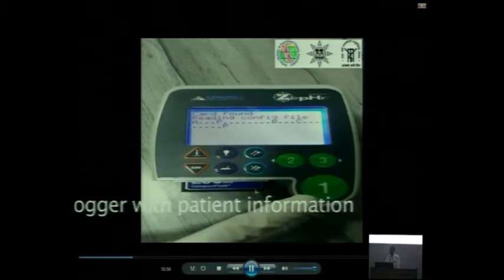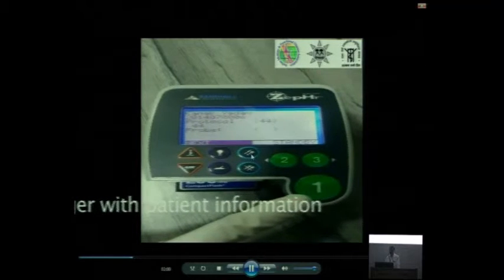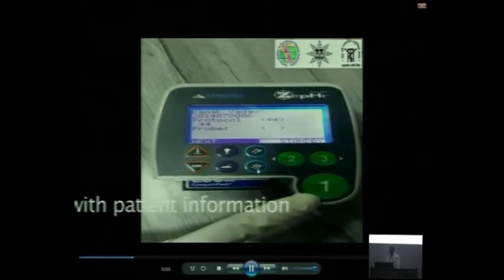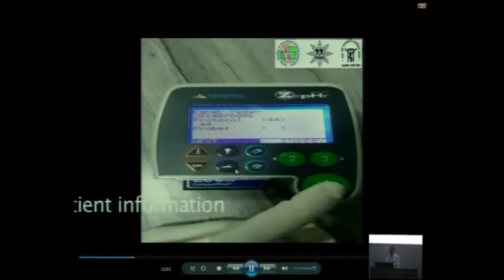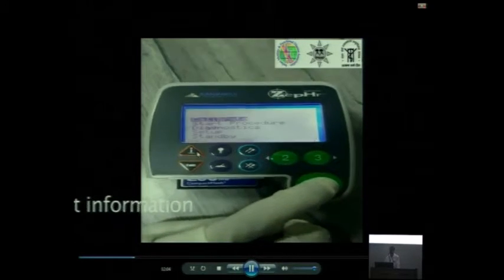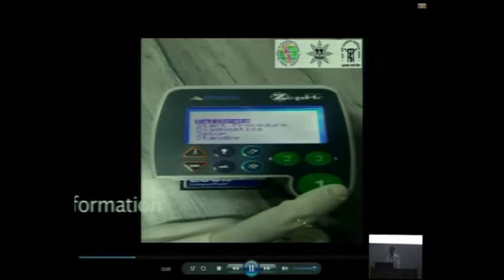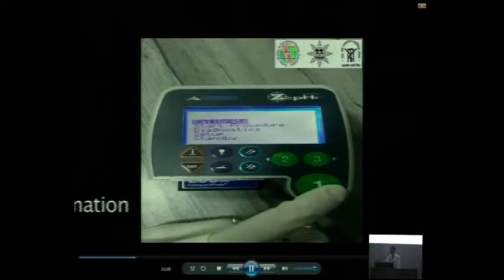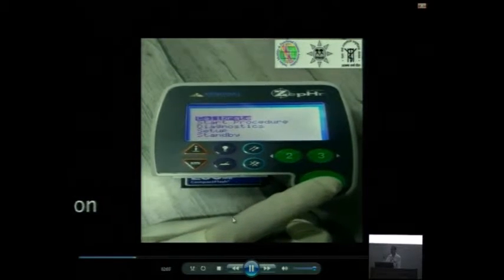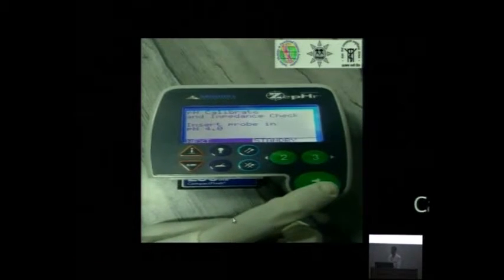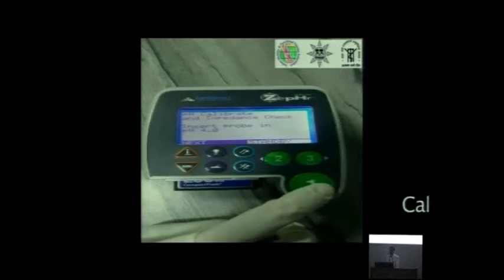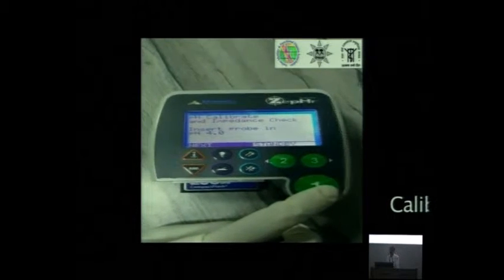All these are - this is starting of the meal, this is the end of the meal, this is lying down, this is standing up. These are the keys which patient has to press during the recording. Then you have to do calibration.